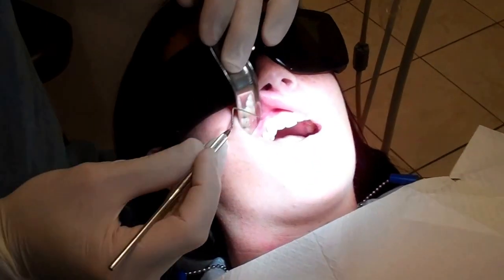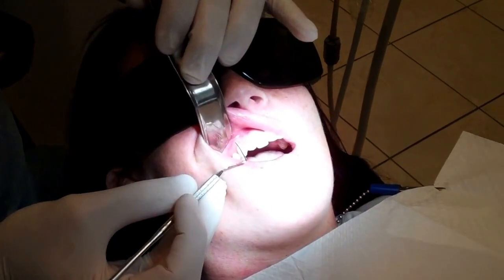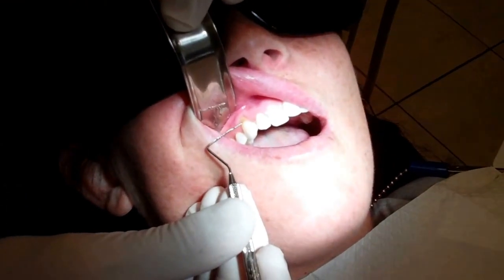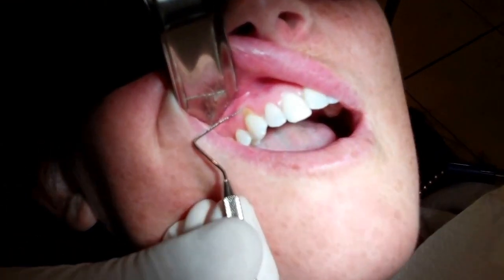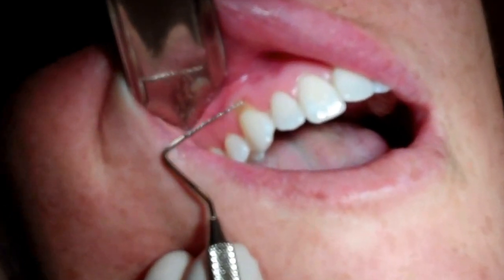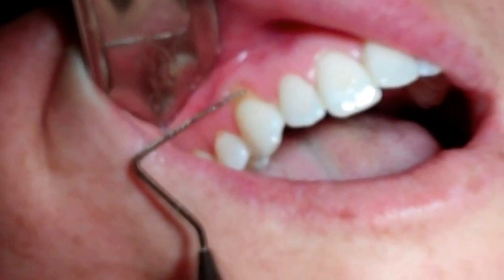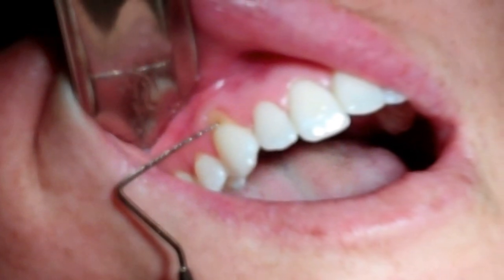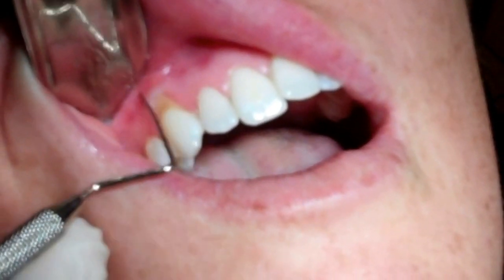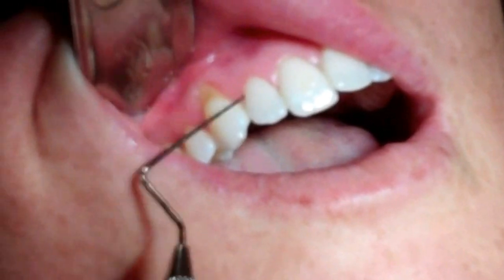So in number 6, she's got some pretty extensive recession, approximately 4 millimeters on the facial. Again, we're going to measure from the CEJ to the marginal gingiva. So that's the amount of recession that she has. You can tell she's had some flattening of the root. I do not think it's from toothbrush abrasion. I think that isn't all that common, quite frankly. It's more of a genetic predisposition that she doesn't have a lot of attached gingiva.